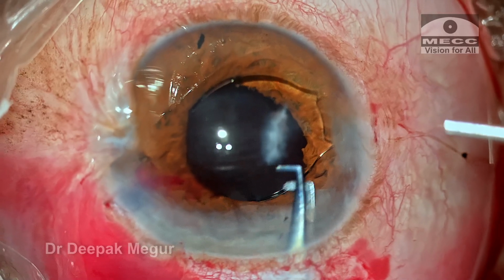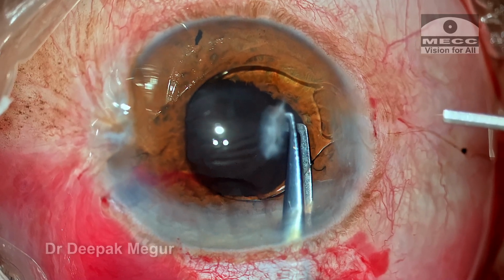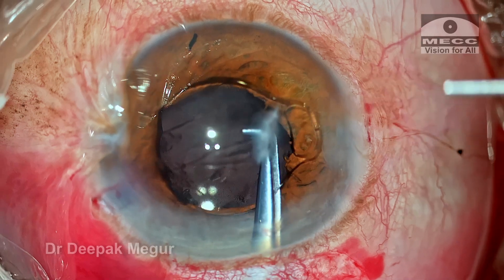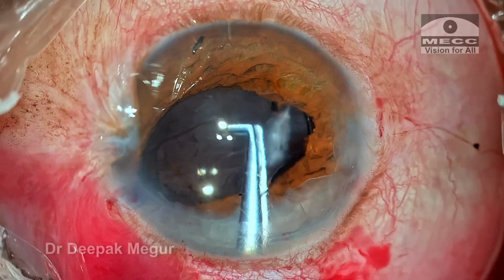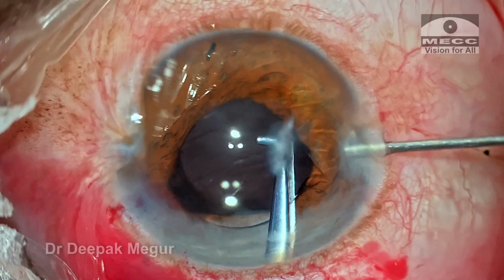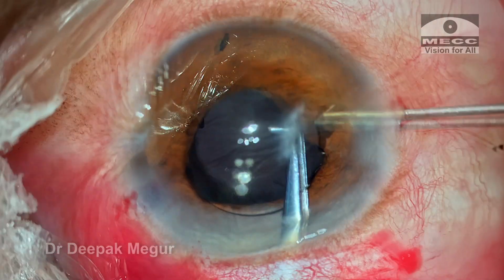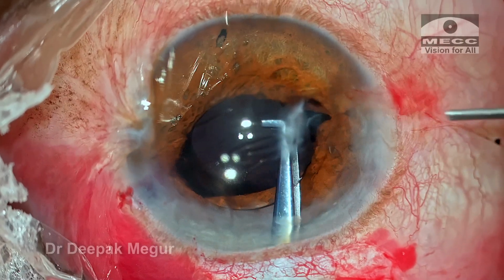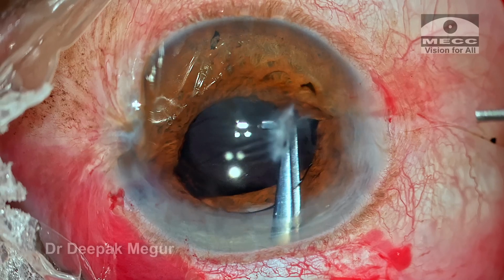Again, please note the position of the forceps as it is being held. It is nearer the edge of the optic, and the position of the tip of the forceps exactly coincides with the notch on the haptic. The haptic is slid under the iris, and then the haptics are pushed up against the iris. And now I'm going to introduce the cannula and stroke the iris over the haptic at the right point so that we have a nice enclavation.